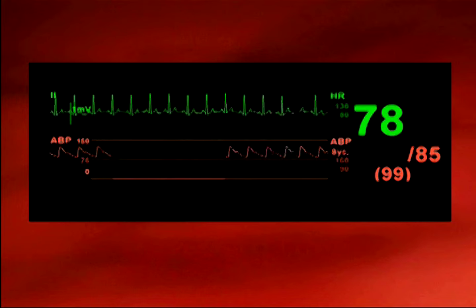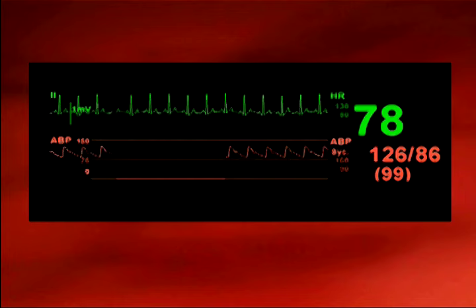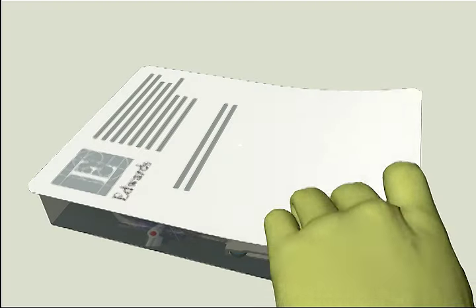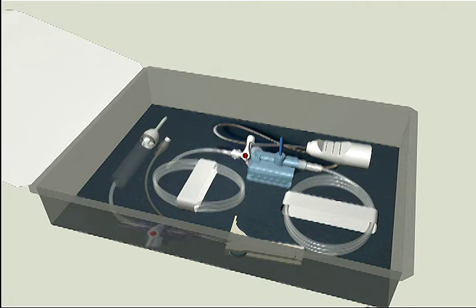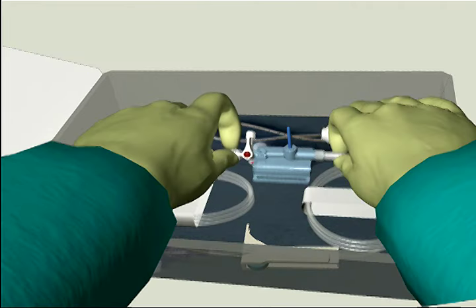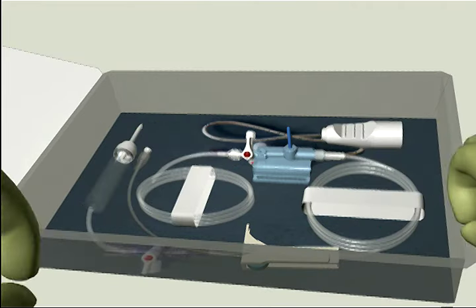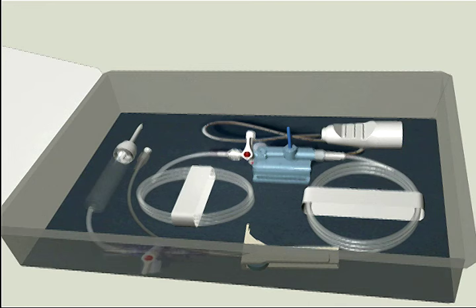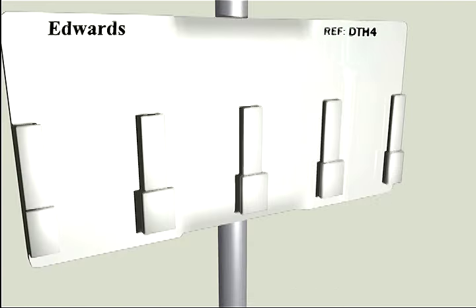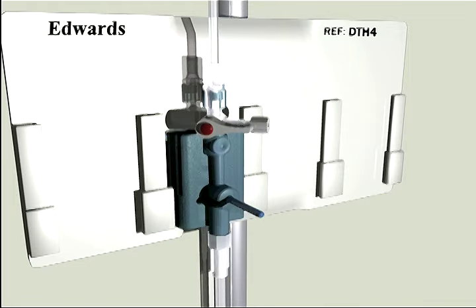Prepare the TruWave transducer using the following six steps. Step one: using aseptic technique, remove the transducer kit from the sterile packaging and ensure all connections are secure. Step two: insert the TruWave transducer into a mounting backplate that is secured on an IV pole.